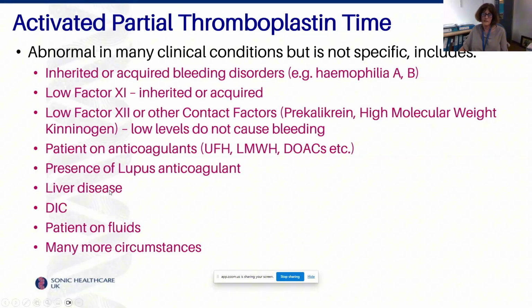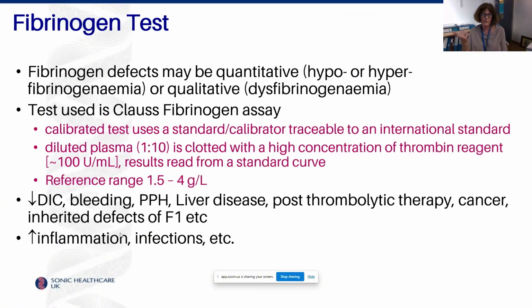Patients with liver disease, it's going to be abnormal. Patients with DIC, patients on fluids, and probably lots of other clinical diseases, the APTT may be prolonged. So I'm going to go through investigation of a prolonged APTT after I've been through the routine tests.